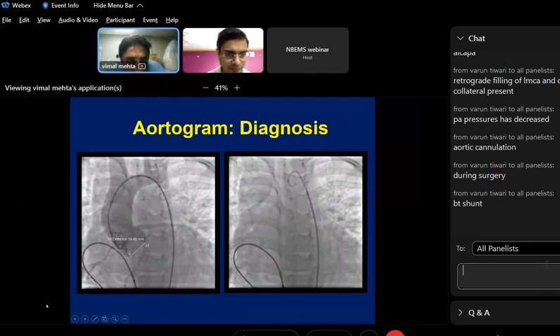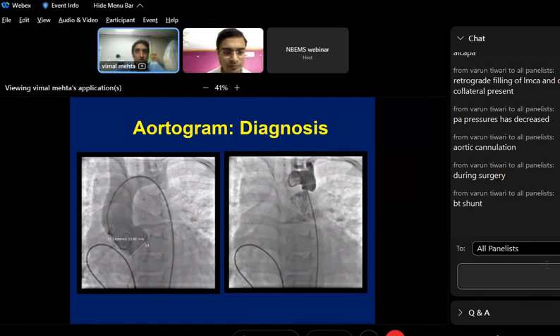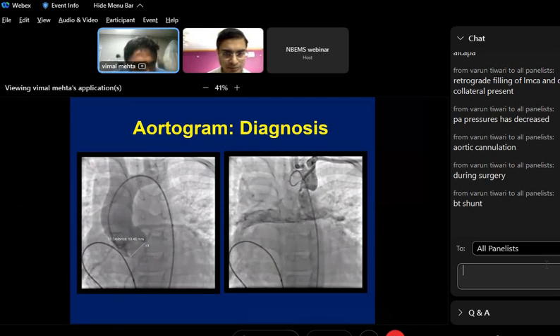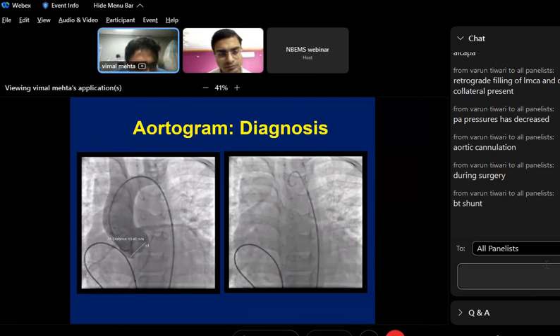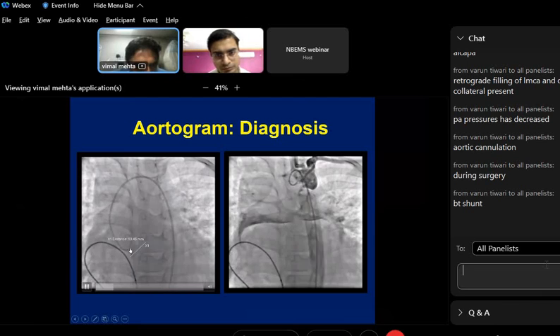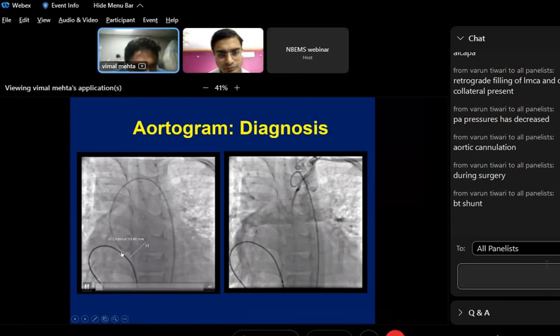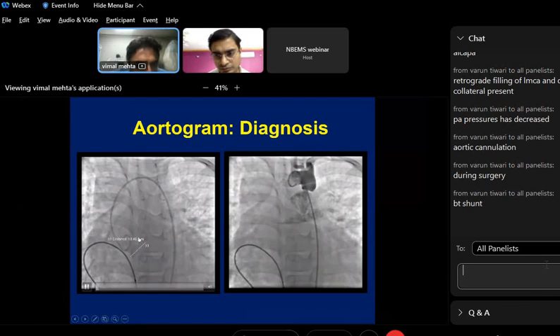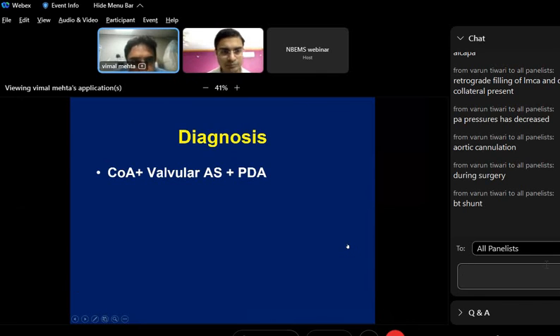It will be something like somebody entering in a really violent fashion through a door, slamming the door, and then the doors automatically get shut. So here the aortic valves, you see carefully, there is some sort of lucency, and they are not getting shut, not getting open very well. If you see carefully, you have to have eyes to see it, nevertheless.